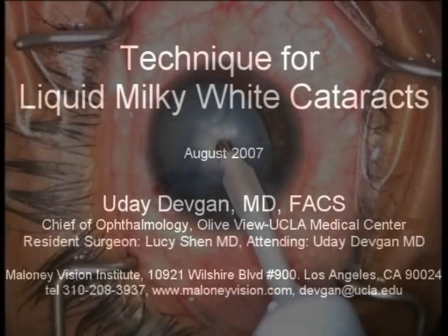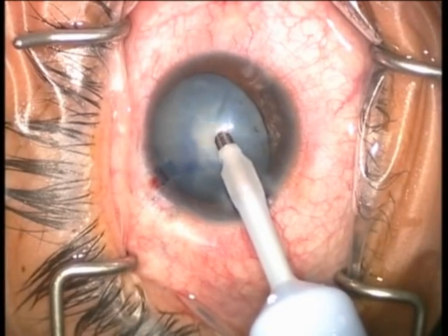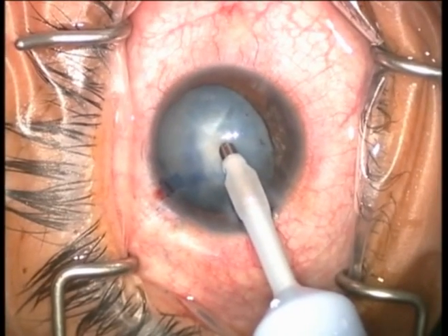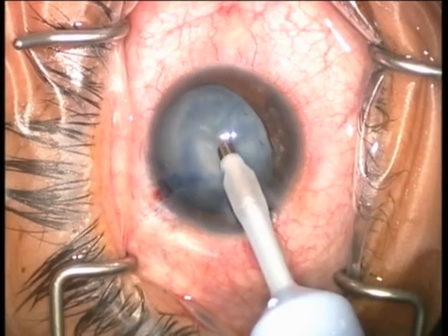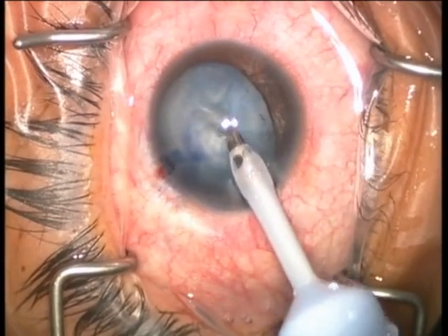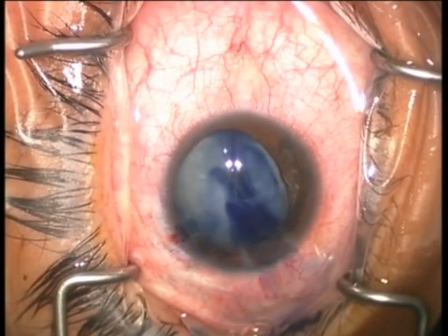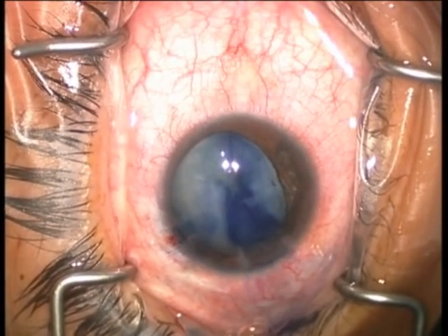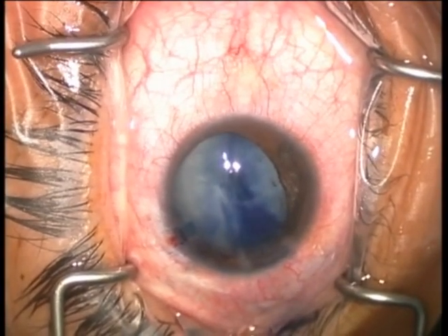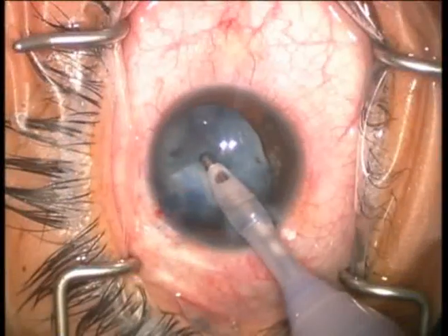This cataract is completely liquid. You'll notice the instability of the anterior lens capsule since the entire lens capsular bag is filled with this liquidy material. We'll use the FACO probe and make a single round opening in the anterior lens capsule. We directly buzz right into the anterior lens capsule using low flow, low vacuum, and high power.